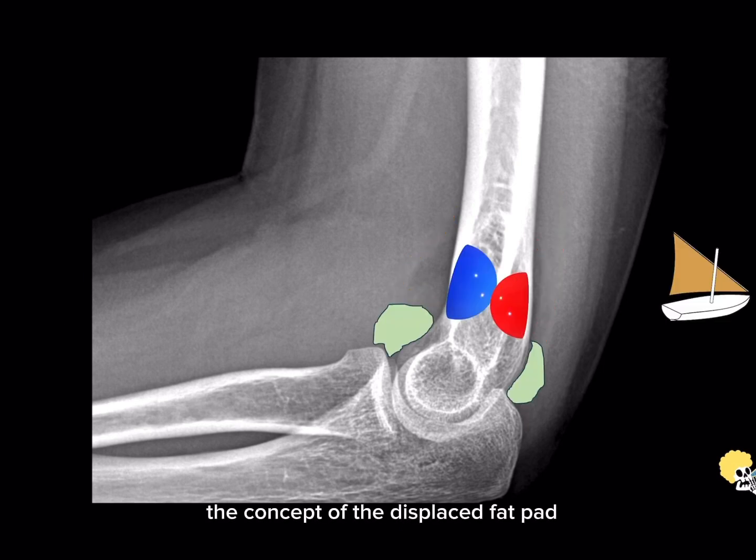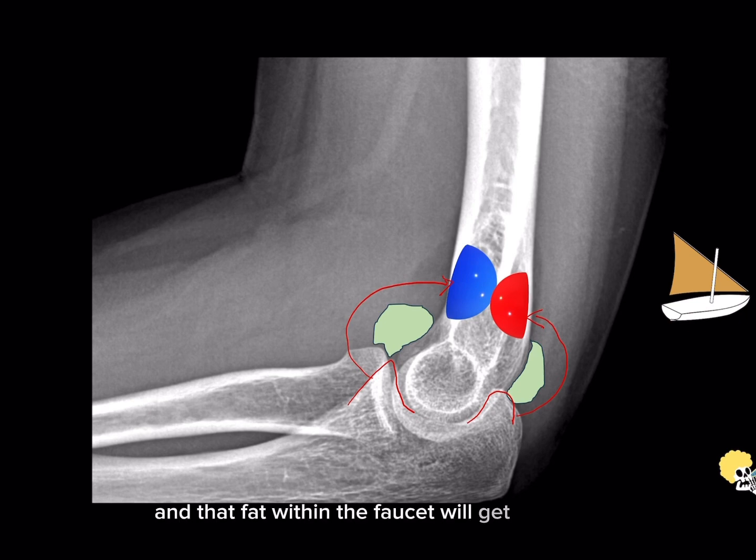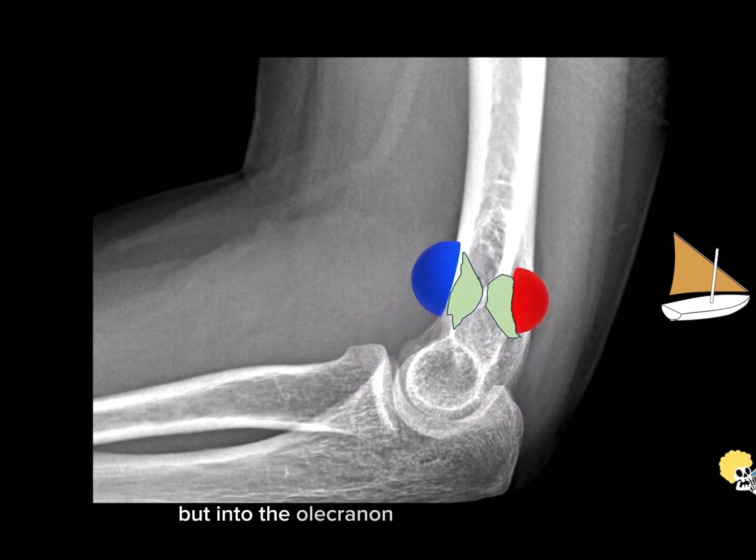The concept of the displaced fat pad is actually very simple. Here is an illustration to better explain it. The blue and red semicircles are the normal fat that usually lives within the coronoid and olecranon fossae respectively. Normally this fat gets displaced by the flexion and extension of the elbow. When we have full flexion, the coronoid process will go into the coronoid fossa and displace that fat. Conversely, with full extension the olecranon accommodates within the olecranon fossa and displaces that fat. However, when we have large effusions of the elbow joint — depicted by the green structures — it gets bigger and bigger and has nowhere else to go but into the olecranon and coronoid fossae.